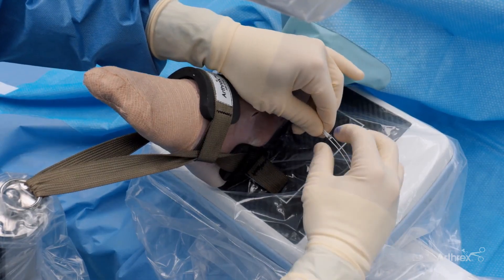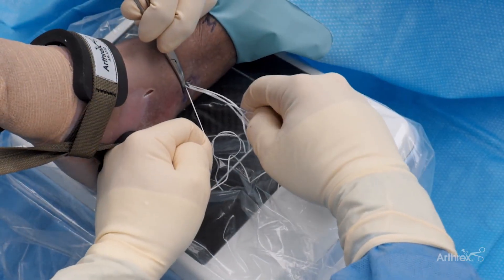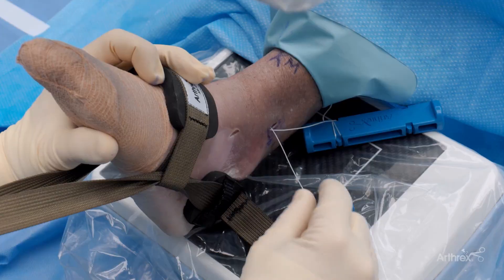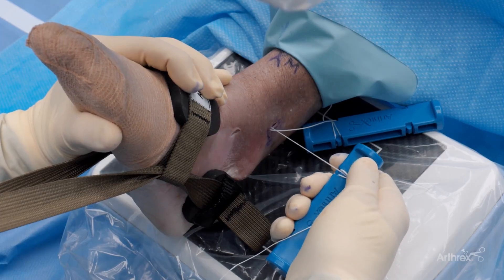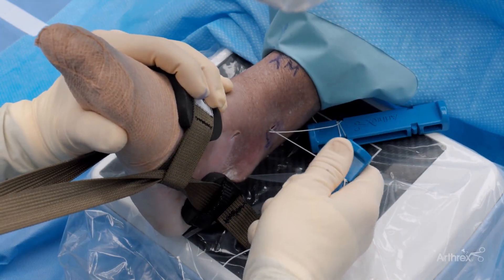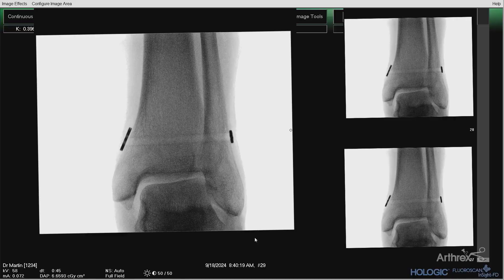Looking laterally, we pull and slide the button down first and hold it — this prevents any looping or tangles along the suture. Slide it down very nicely. Then we pull them side to side evenly, ensuring there are no loops or tangles, back and forth slowly, making sure to pull at the same angle we drilled, securing the button directly on the cortex. After pulling the button down under the skin, we attach our blue handles relatively close for better control. We sequentially tighten them one at a time, pulling in the same direction we drilled. You can feel the creep come out of the sutures and the knot snugging down. We go back and forth until we've got enough, and then repeat the stress examination to evaluate the syndesmosis, applying a little more tension if needed.